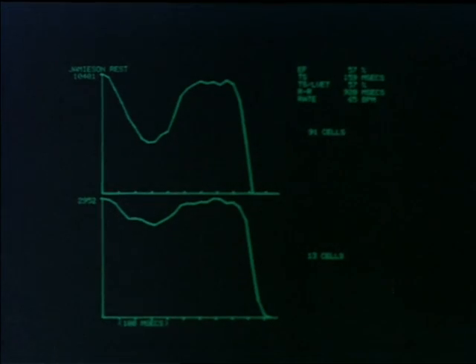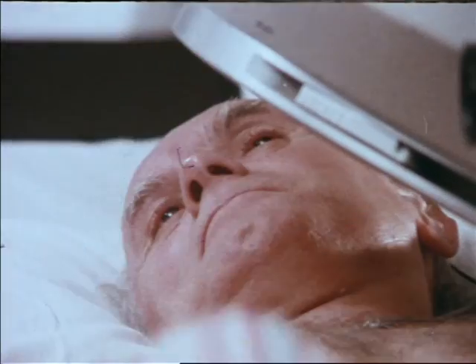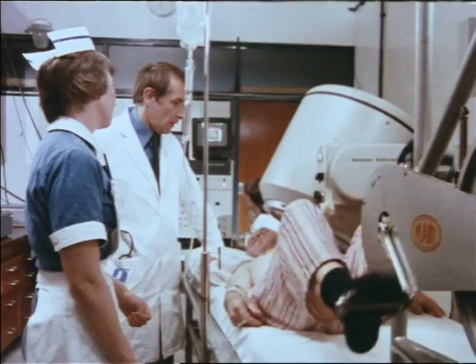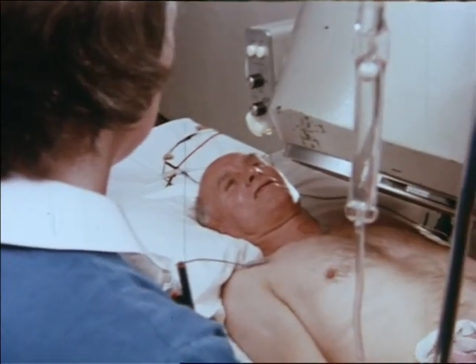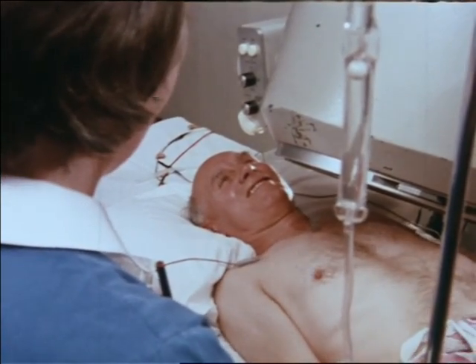Okay. But under exercise, the heart must work much harder. How's it going? Good. Now, you're not short of breath at all? No. Excellent. No pain? No pain. Excellent. The demands of the body for more oxygen mean that more blood must be pumped through it. Will the patient's heart meet these demands? You're not getting far on this bike. I wouldn't go far on this bike. That's super. You're doing well. The heart beats faster, but that yellow patch is almost constant. Even less blood is being pumped out.